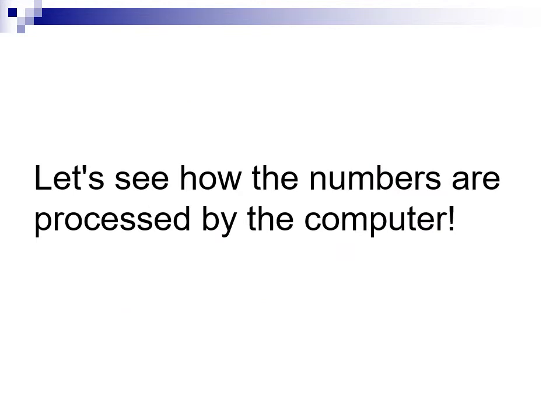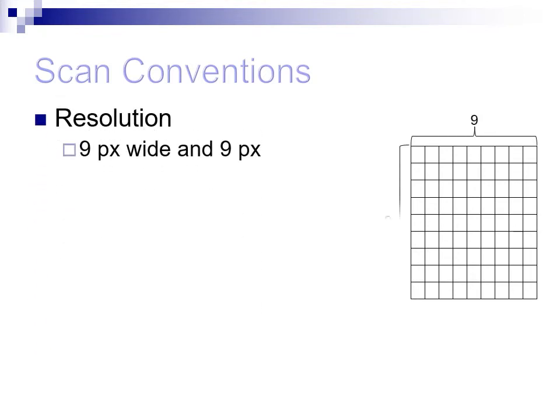Let's spend some time and see how the pixels on a plate are converted into an image. For this example, we will use a simplified hypothetical PSP plate. To keep things simple, we will limit the plate's dimension to 9 pixels wide by 9 pixels in length. Our plate has a total of 81 pixels. Real PSP plates have literally millions of pixels. Computers are good at sorting and making sense of large quantities of data like this.